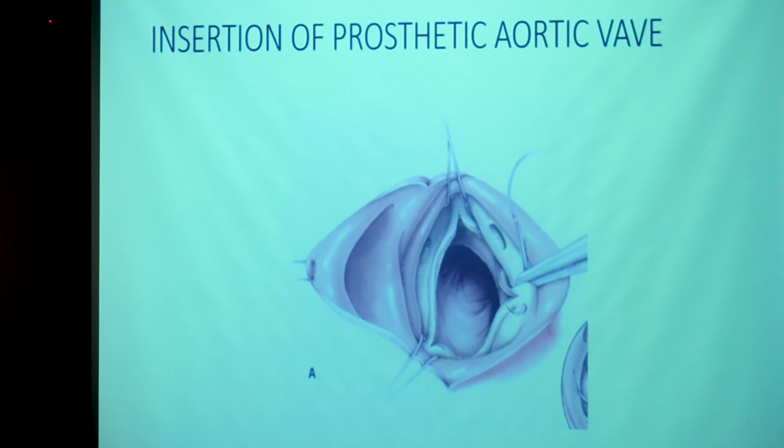Now the sequence of suturing. Then you size the aortic valve with the valve sizer, and you take 3 simple sutures in the area of the commissures. The thing is, the aortic annulus is not a planar structure. When you are trying to take these sutures, you need not retract. If you retract the area of the aortotomy here, you cannot see this. That's why it's better to handle with 2 forceps here, so that you can see this commissure. These 2 sutures can be taken forehand or backhand depending upon your preference.